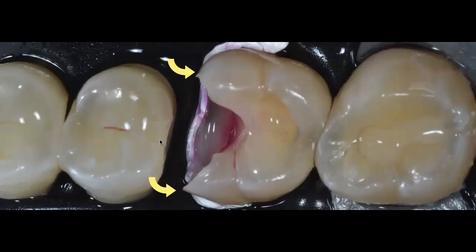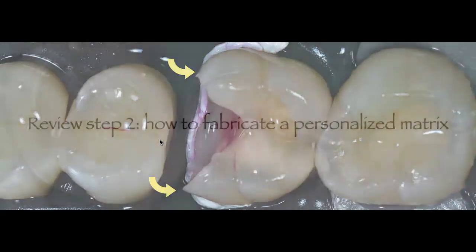So I only need to restore one tooth, and if I use the wide prep band, most likely my contact is either going to be non-existent or very, very light, again because of the reduced pressure that this type of ring exerts over the teeth that it is held on to. So please keep that in mind. So for a case like this, what would be the ideal situation? This is the ideal case for a personalized matrix band.